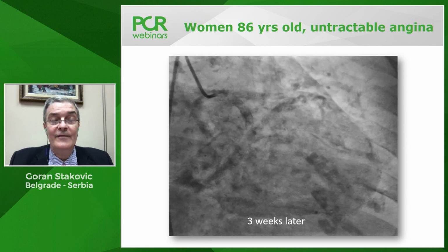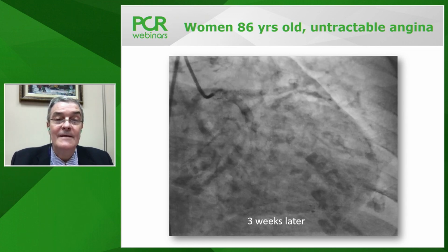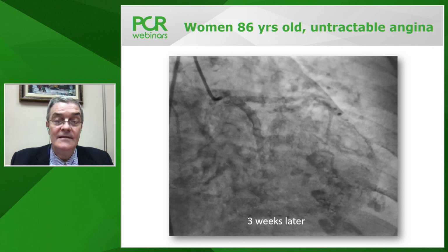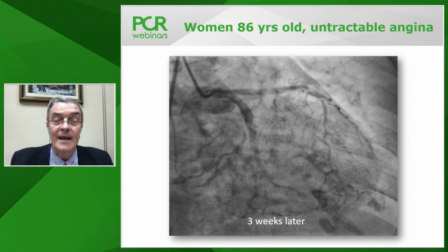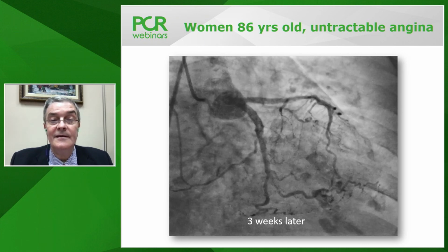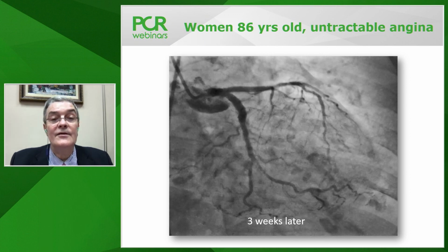I think all three of us should express our position on this kind of statement, because I just moderated a couple of weeks ago a live case from India, and there was an ostial LAD lesion, and they did OCT. There was some moderate disease in the circumflex, no disease in the left main, and the strategy was DK crush.